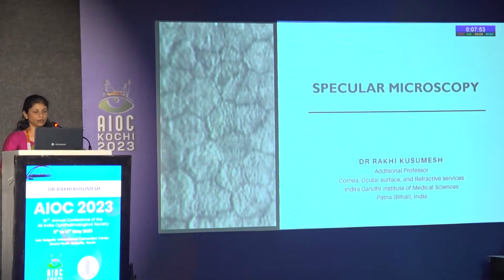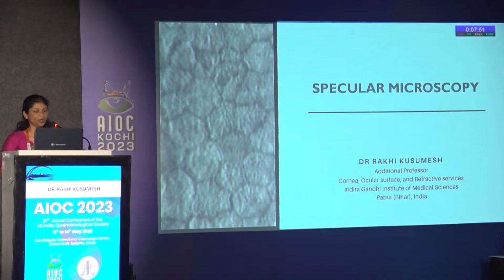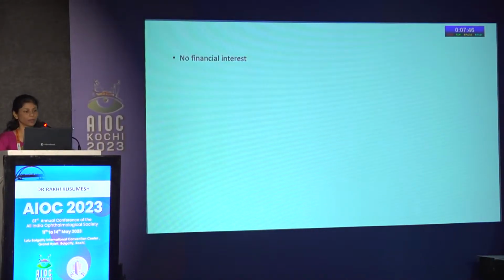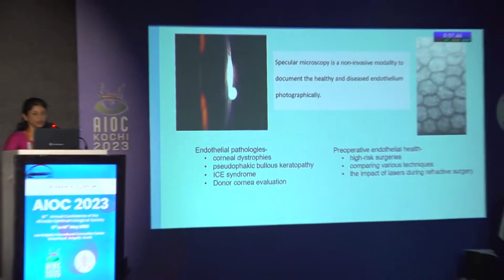So I'll be highlighting some important points: how to interpret specular microscopy and what its clinical implications are. I have no financial interest.